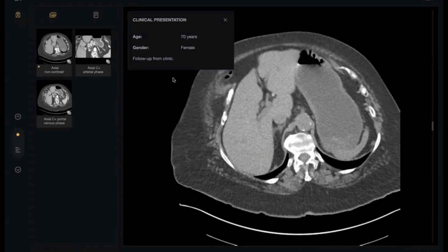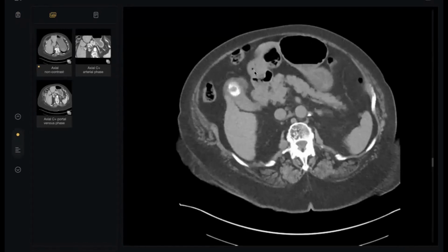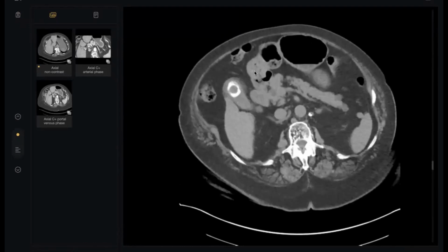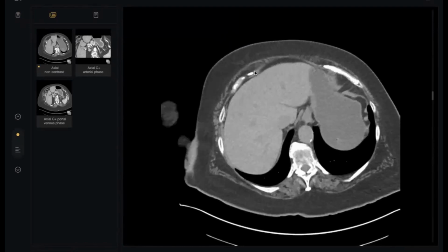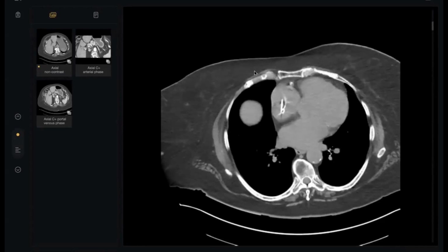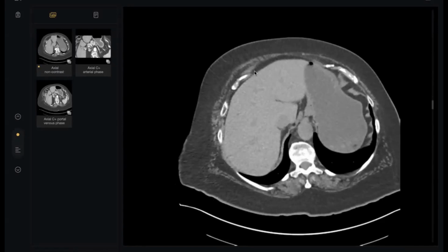70-year-old female patient for follow-up. My colleague, by the way, GIT, in my opinion, is the most important and the most difficult because it contains endless pathology, and the GIT itself contains many organs. I think I said this advice before. So my advice to you, you will find at least one case in the long reporting. It must be GIT.